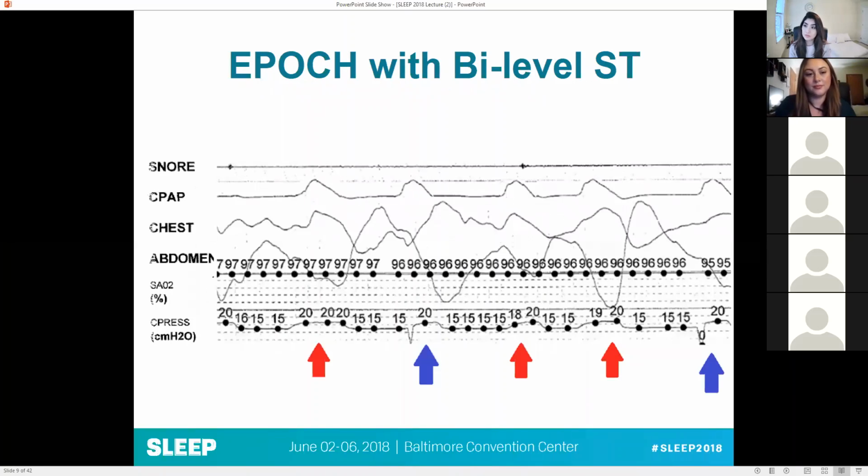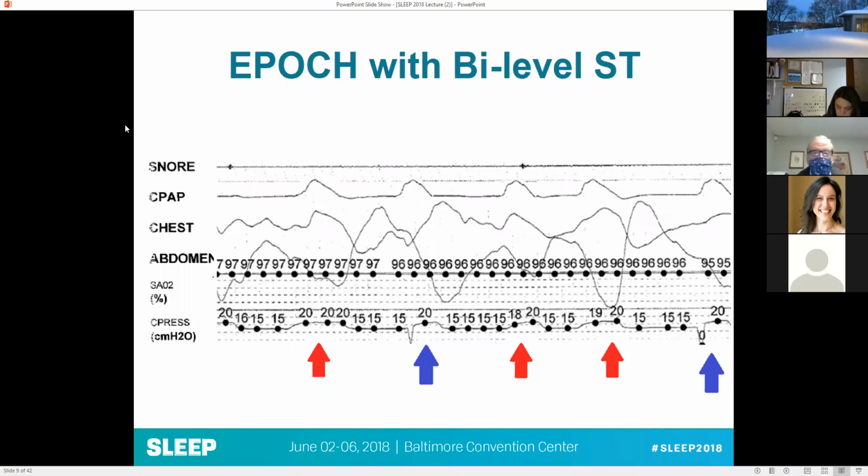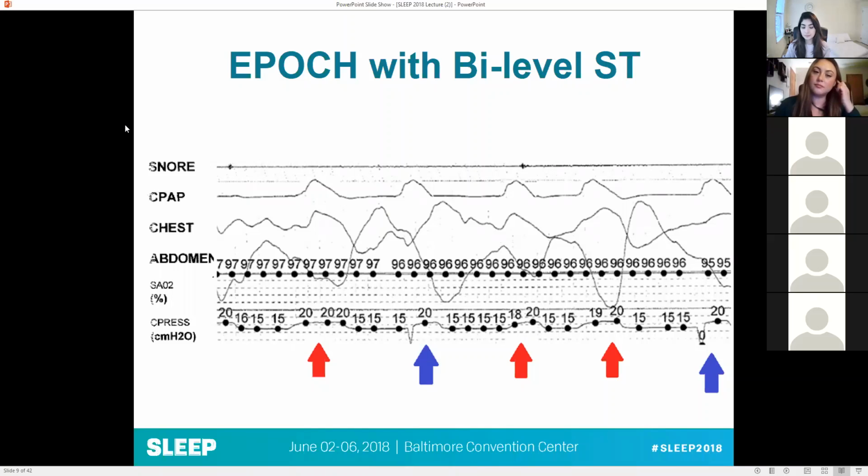And you move to the next slide, and you can see that this has all resolved as the machine is actually kicking in to deliver those breaths. And when you see dips in the flow and effort, that's when you can tell that there's a breath that the patient's giving. And then if, say, this patient didn't have a breath in 6 seconds, that's when the bilevel might know, hey, it's time to give them a breath. They haven't triggered one on their own. Next slide.